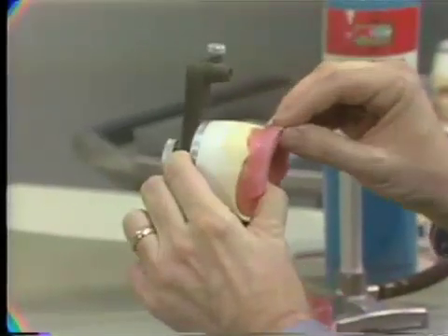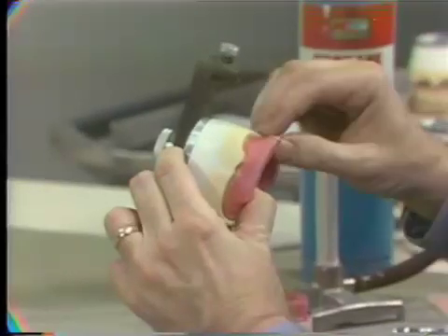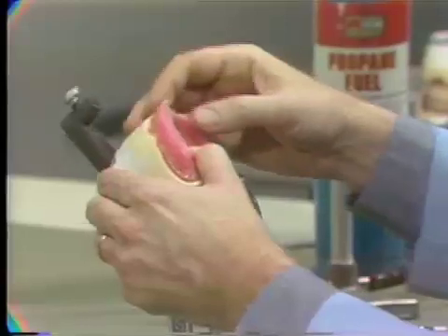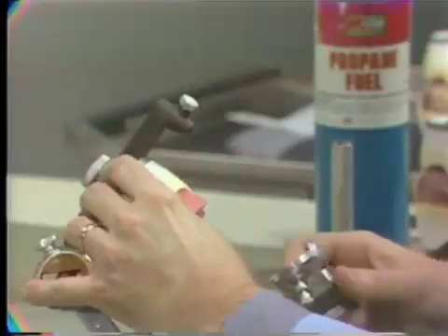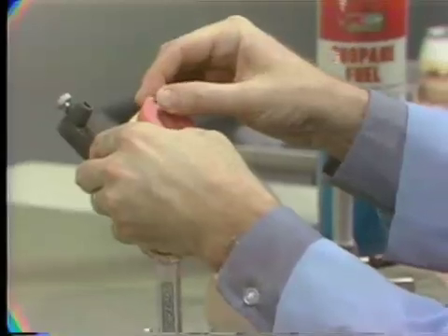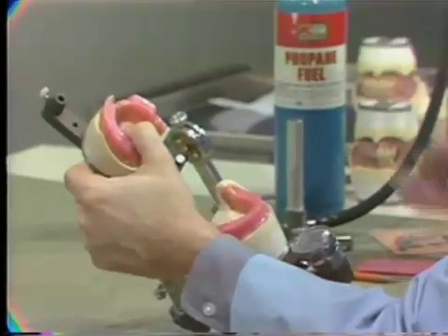Now I want to remind you at this time what is mentioned in the handout, that is, don't use the red utility wax to set the teeth. We will use the pink base plate wax for the entire setting of these teeth. Now I'm looking at this myself in several different directions, and in a moment I'll show you exactly what I'm looking for as I get this central in a satisfactory position so we can go on to the next teeth.